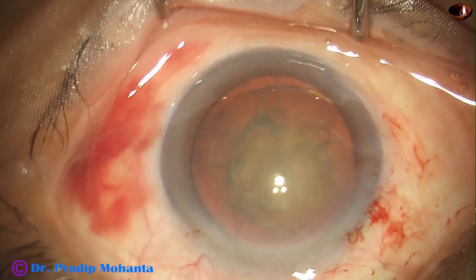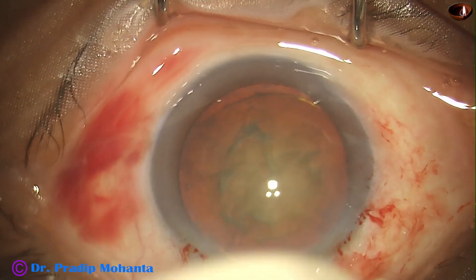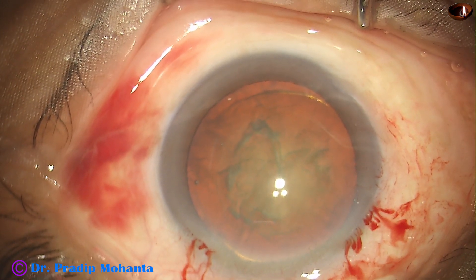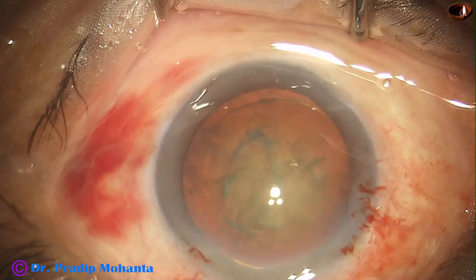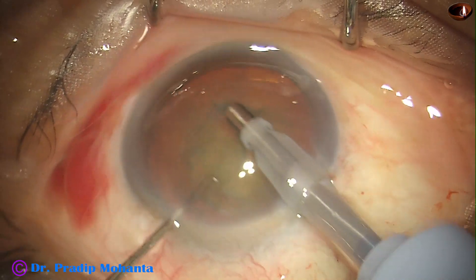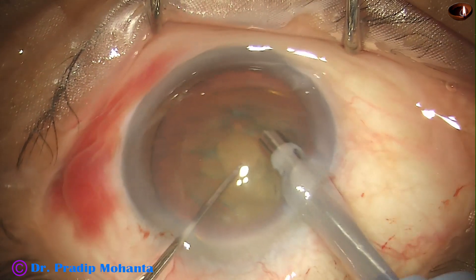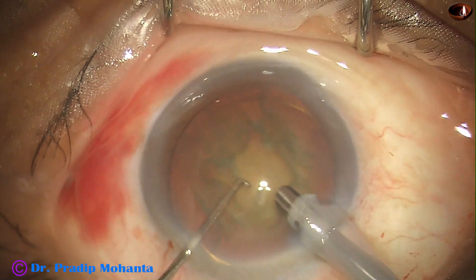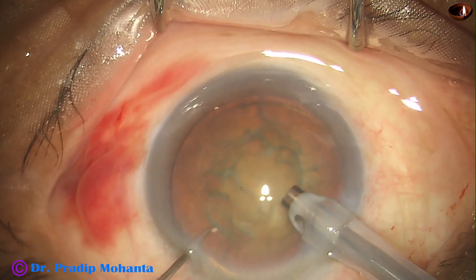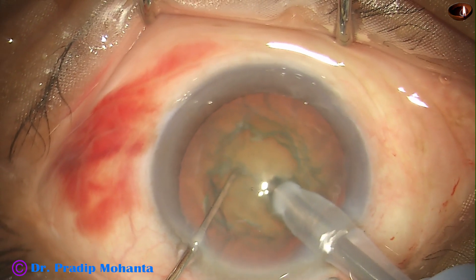The nucleus is rotated. Now it's time to introduce the phaco handpiece. The machine I am using is the Galaxy Leo phaco machine from Appasamy Associates. This machine has active fluidics, and the anterior chamber stability is just superb.